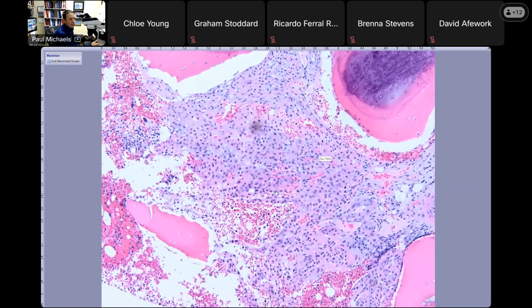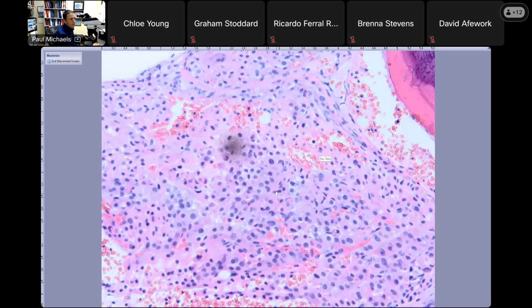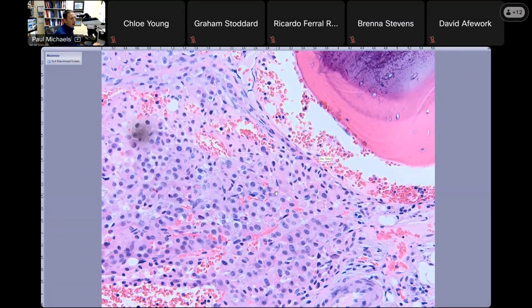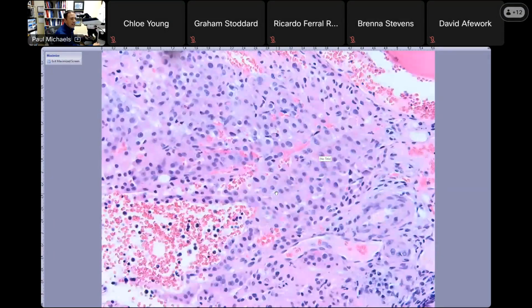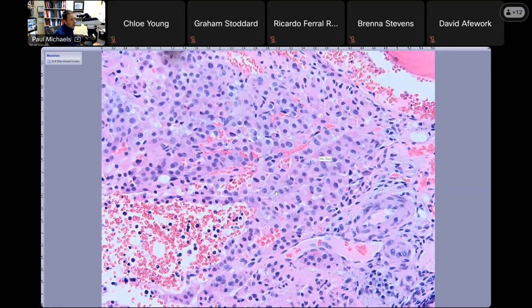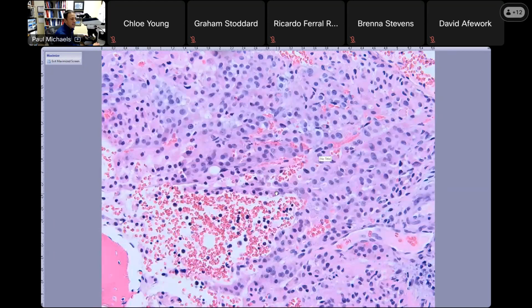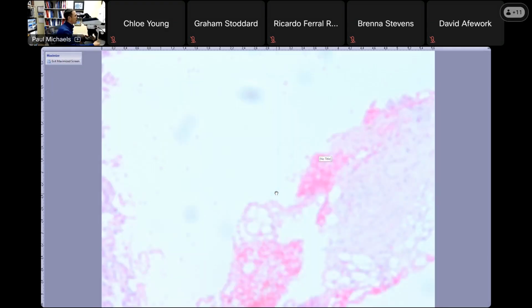This was an oncocytic carcinoma that went to the bone. More often it's the bone in the upper body, head and neck area, but it can go anywhere. If you don't have that history, I think this would be hard. And again, this would be TTF1 positive. So if you don't think to do Pax8 or Napsin or something to say that it's thyroid, or thyroglobulin, I think you could easily miss it. Well, I think we tend to forget about thyroid as being an aggressive tumor.